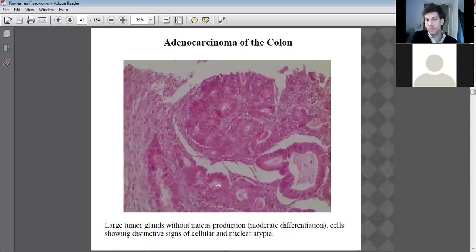cellular debris is accumulating, the rough border forming means that it's degenerating. And all over, there's loss of cell function, if you like. So the nuclei are becoming abnormally divisive. They're dividing atypically, if you like. And yeah, it's sort of a total loss of function.